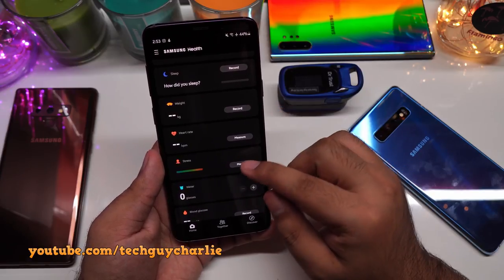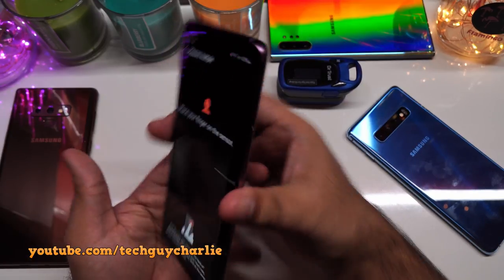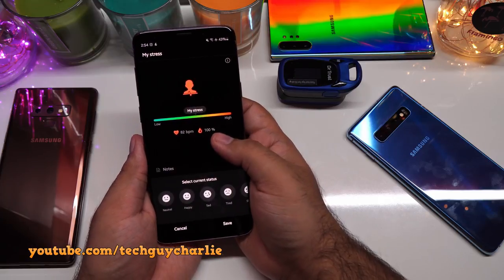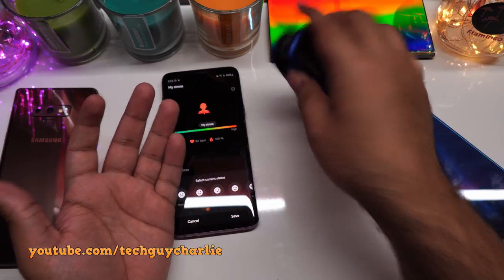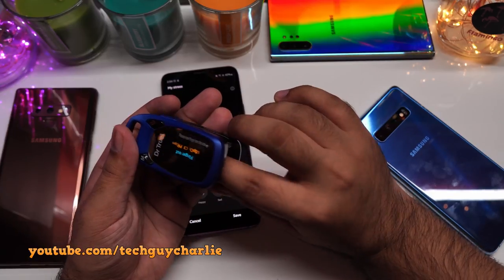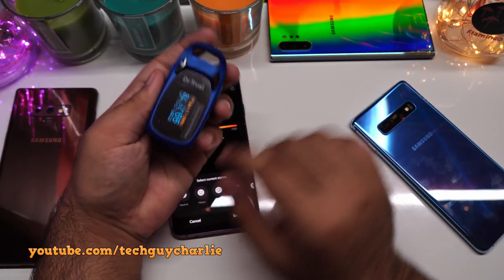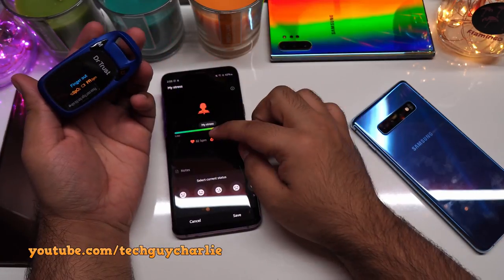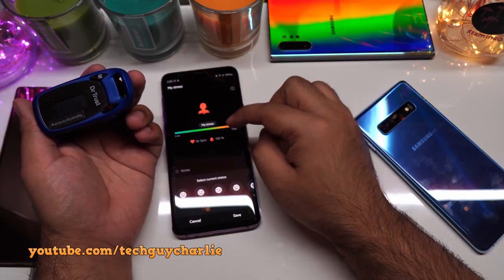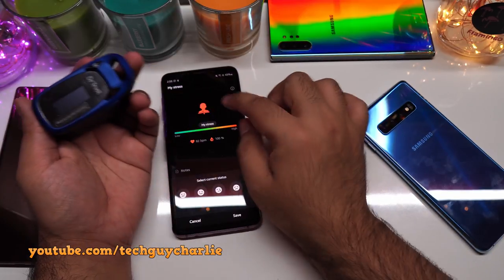Now measuring SpO2 levels on the phone again and comparing with the dedicated meter — the phone is showing 100% oxygen saturation. The dedicated meter, which I've never seen show 100%, is showing 99% SpO2 and a pulse of 78. That's within the margin of error, so the sensor on the phone is pretty accurate, though the dedicated meter is still a little more reliable.